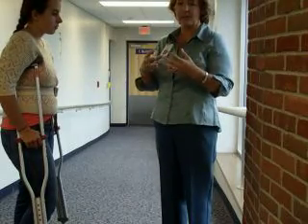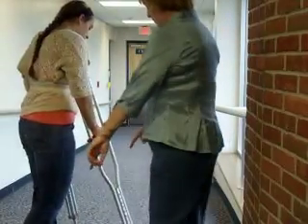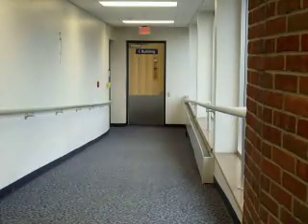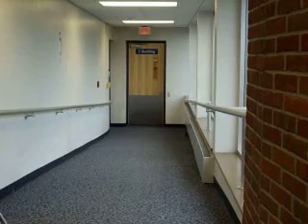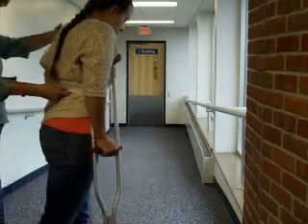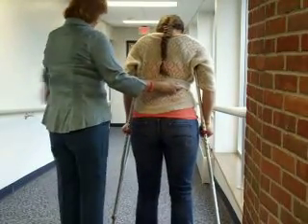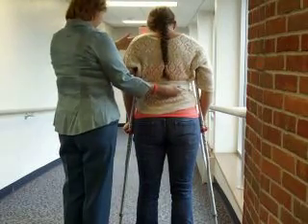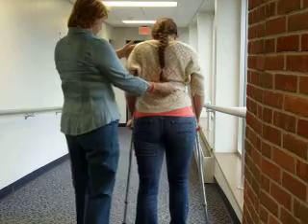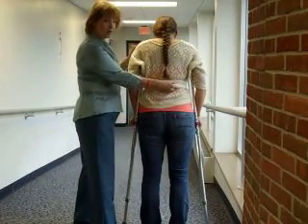Let's start back here and do a couple of steps up to the ramp. I'm going to be on this side so it's easier for the camera to see. So we're walking up to the ramp with crutch, foot, crutch, foot. And when she gets to the top of the ramp, now she's going to go with crutch, crutch, foot, foot — either crutch and any other one, and either foot and any other one. The only thing that matters is that both crutches go down before her feet start going down.